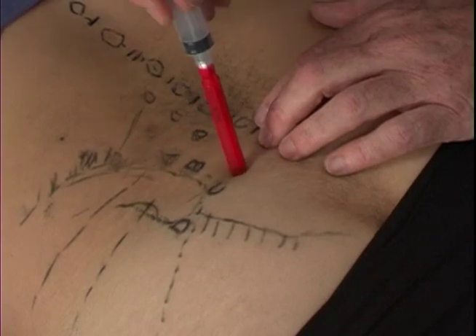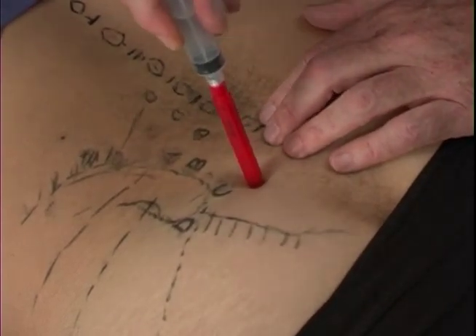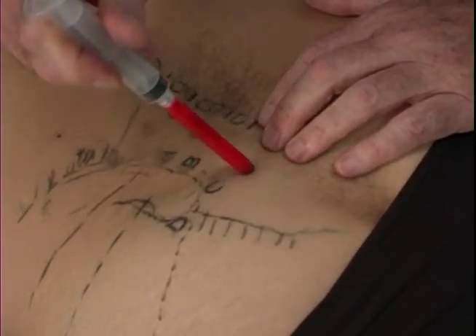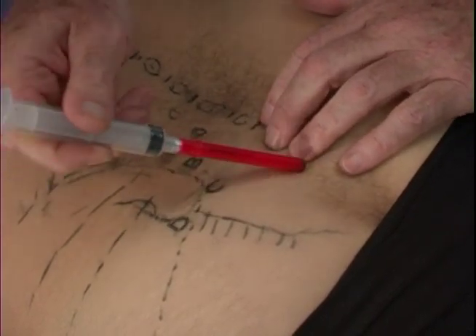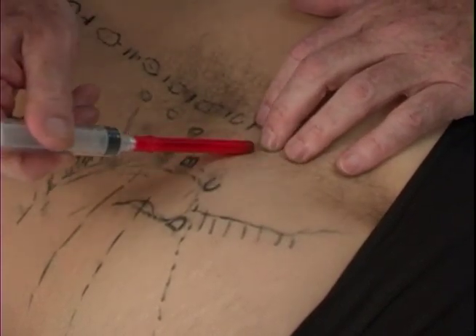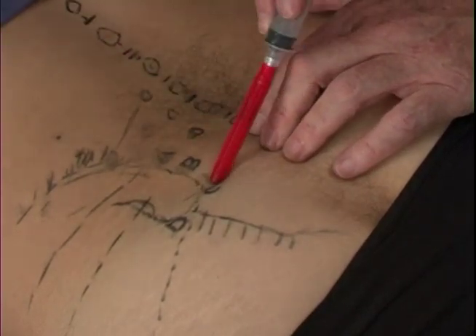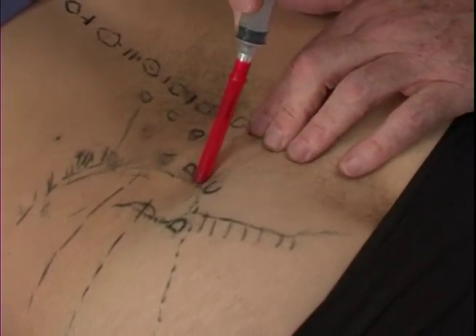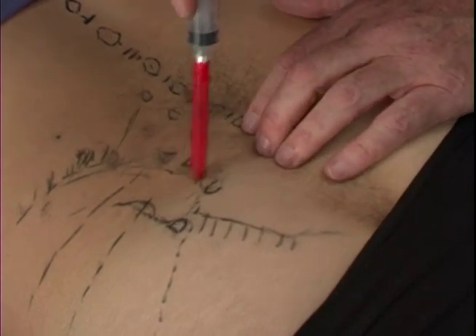We never want to put our needle into this area straight down because you can get into a foramina and cause nerve damage. Some injectors will reorient their needle and inject medially onto fibers next to the spine, but I think most injectors are just focusing on the lateral portion of these fibers as that's the area that seems to be tender the most frequently.